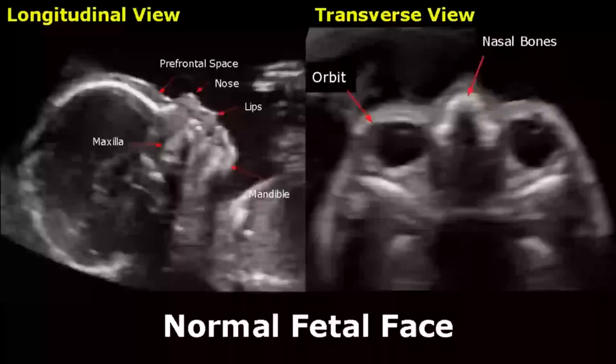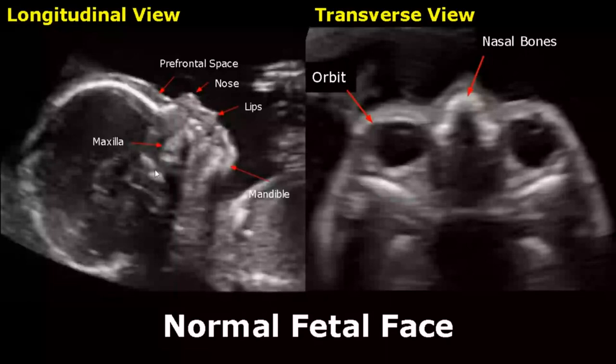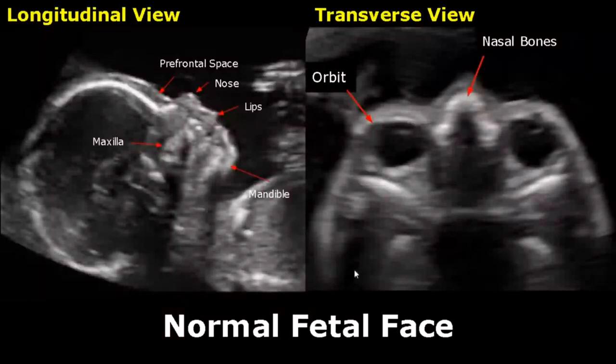Hello everyone, this is Dr. Sam and today we will study fetal face ultrasound. Scanning the fetal face requires high quality equipment and experience. These are longitudinal and transverse views of fetal face. The sagittal facial profile is best for evaluating the face.